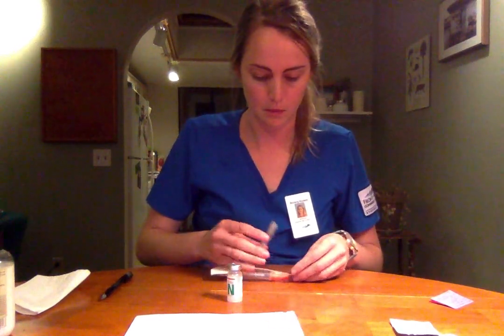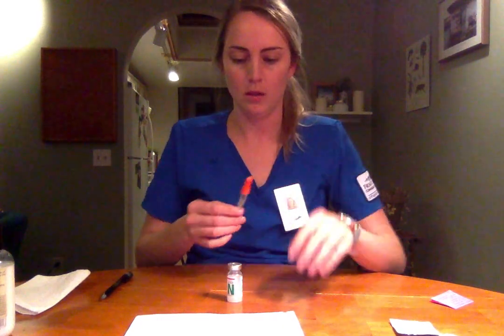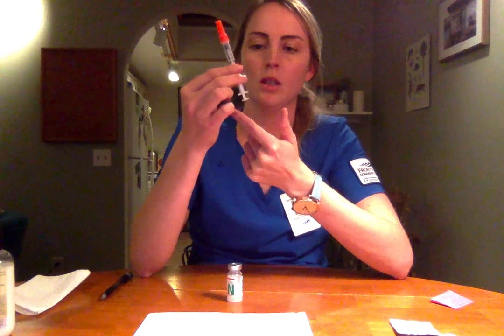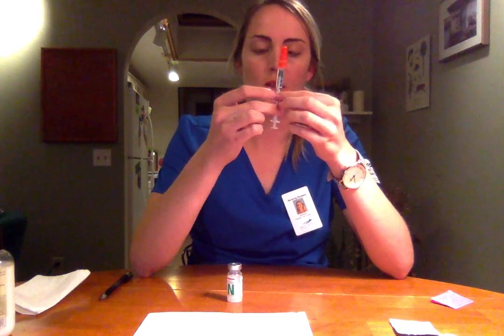So now that vial's ready, I'm going to open up the syringe, maintaining sterility. Okay. So I'm going to make sure that I'm maintaining sterility of the syringe. I'm not going to be touching the inside of the plunger here, and when the cap is off, I'm not going to be touching the hub as well. So first I'm going to draw back 26 units of air.